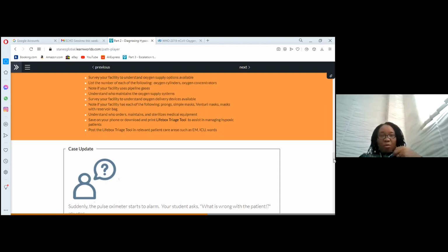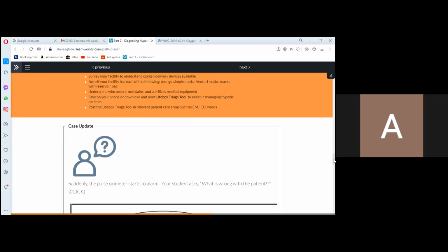So I say, use the oxygen concentrators. When we have a power outage, which happens, there's a cylinder there. So we don't exhaust the cylinders a lot, especially, we know with COVID, the demand for oxygen has been a lot. So we're able to maximize the amount you have in your cylinder while using more of the concentrators, as long as the patient is not intubated. So that's just something that has helped us in judicious use of oxygen. Thank you. Thank you very much, Irene.